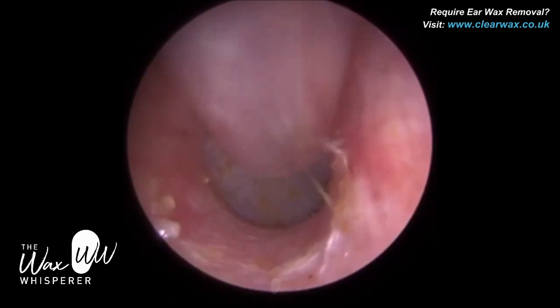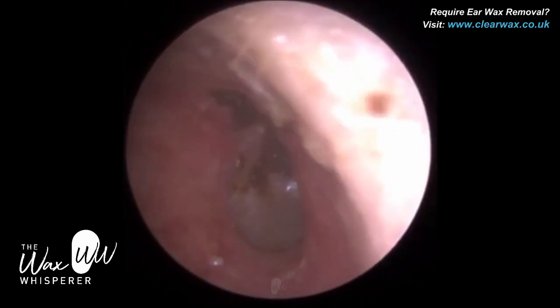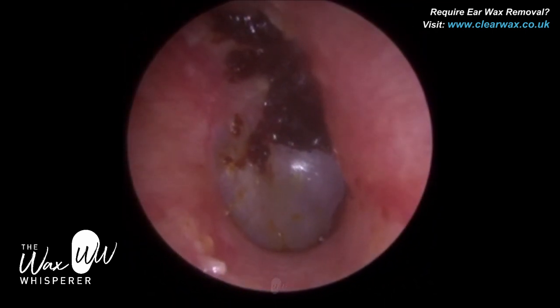We call that the front part of the ear canal. So on the right ear, the front part is the right side of the ear canal — we call that the anterior canal wall. The Q-tip slightly bruised that.